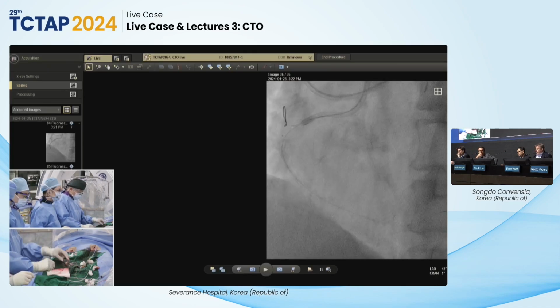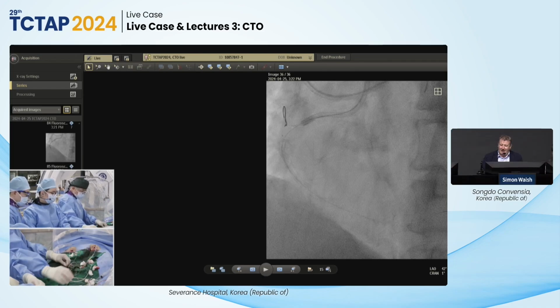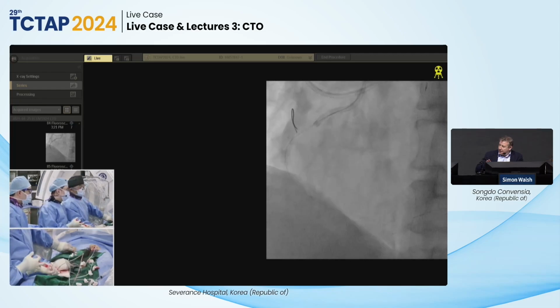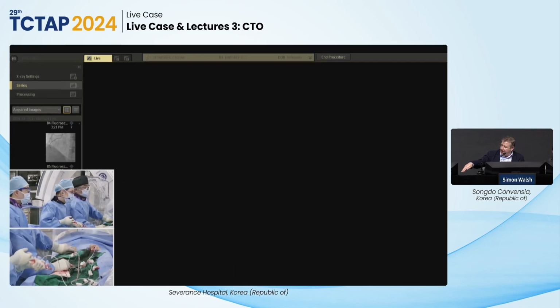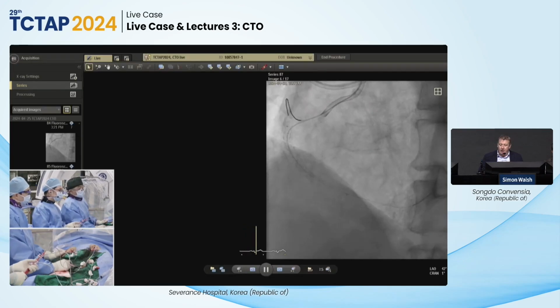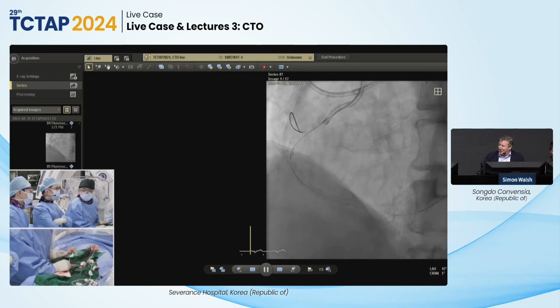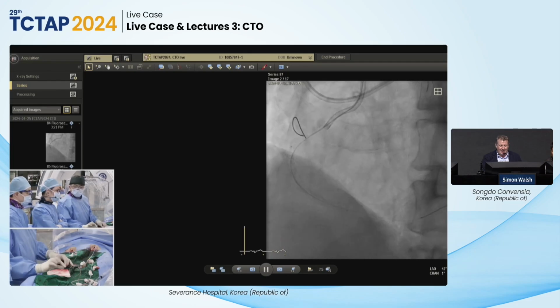Yeah, certainly for those eccentric nodules that are on the unfavorable surface. The classic one being the distal left main, where it tends to have plaque formation on the outer side and carinal sparing. So when you're going into the circ, the burr tends to go towards the carina, and then if you have diamonds on the back, you'll get the inner surface as you retract and ablate coming backwards. Yeah, I would love to have that tomorrow, but it's going to take a while for it to get into clinical practice.